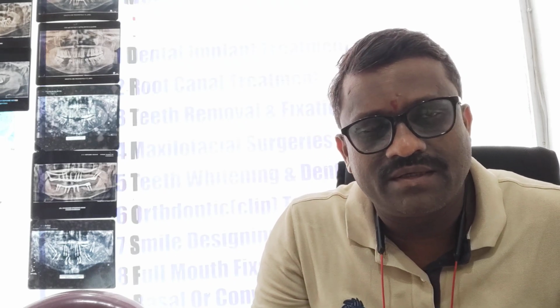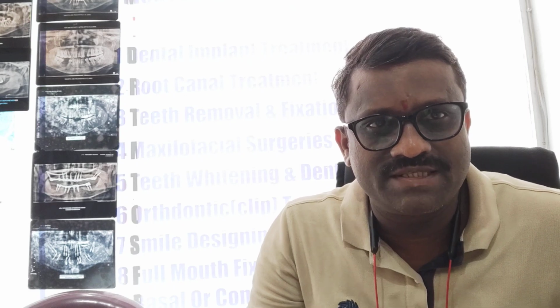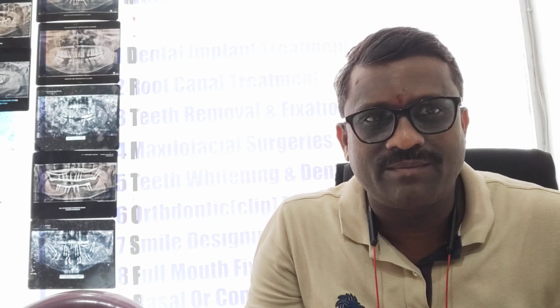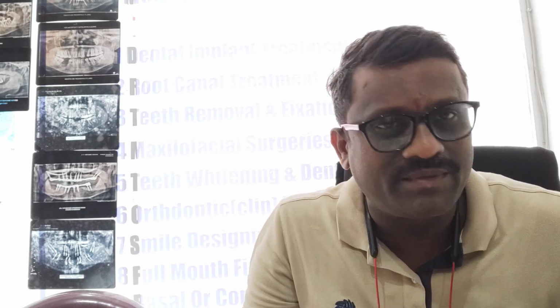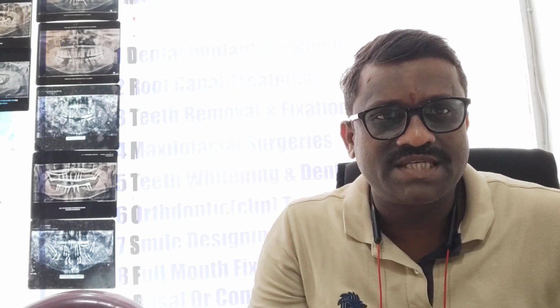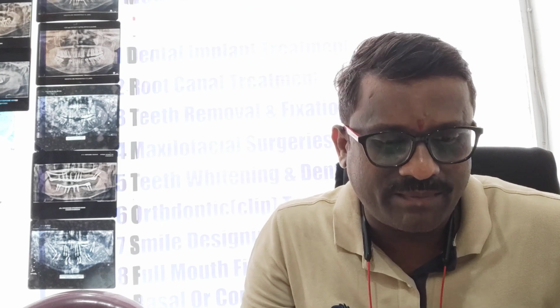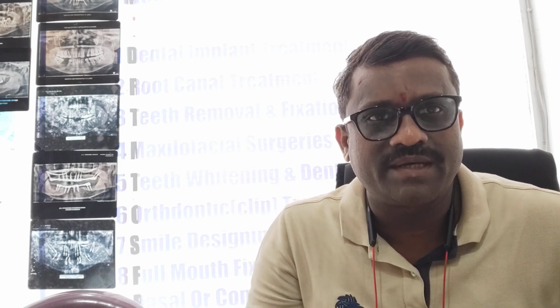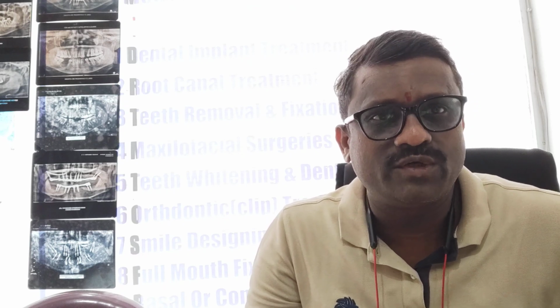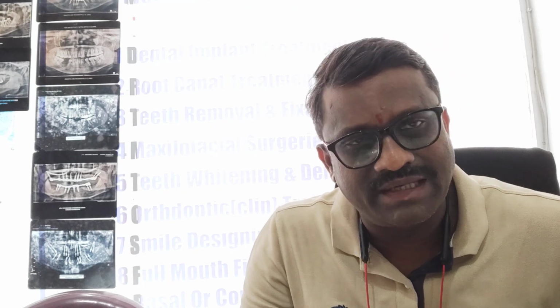Happy Monday morning. Today, a brief discussion about differences in osteotomy between basal implantology and conventional implantology. Usually, in conventional implantology, the method has different steps. That is sequential drilling. First is the pilot drill or the marking drill, then followed by 2 drill, then 2.3, 2.8, 3.2, 4. In that way, we go up to the 4.5 drill.